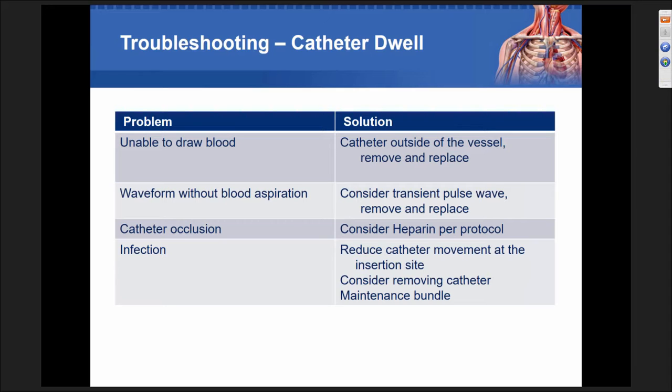Catheter occlusion is something I hear about a lot, and you have to think about mechanical occlusion, meaning the catheter is at the patient's wrist, right at the bend of the wrist, and it's not really down further where it should be. The patient flexes their hand in, just doing that one time, or maybe they're restrained and going for something. Remember who these lines are in, we impact the performance and the occlusion rate just mechanically with range of motion and movement.